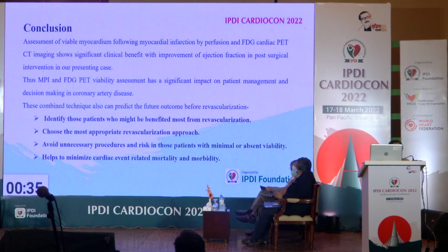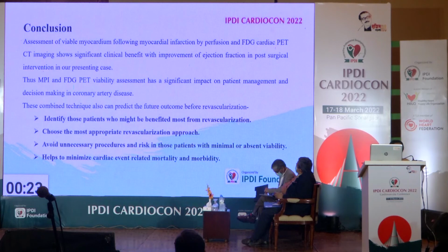So assessment of viable myocardium following myocardial infarction by perfusion and FDG imaging can show significant clinical benefit with improvement of ejection fraction after surgical intervention in our presenting case. MPI and FDG PET viability assessment has a significant impact on patient management and clinical decision making, and it can identify those patients who might be benefited most from revascularization. It can choose the most appropriate revascularization approach. It also avoids unnecessary procedure and risk in those patients with minimal or absent viability, and finally helps to minimize cardiac event-related mortality and morbidity.